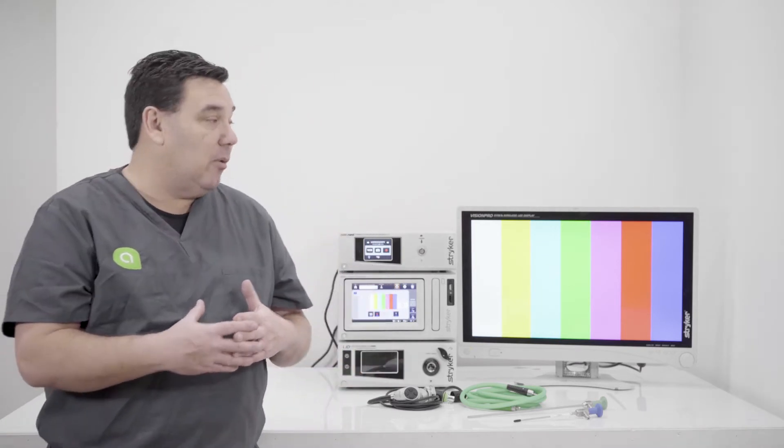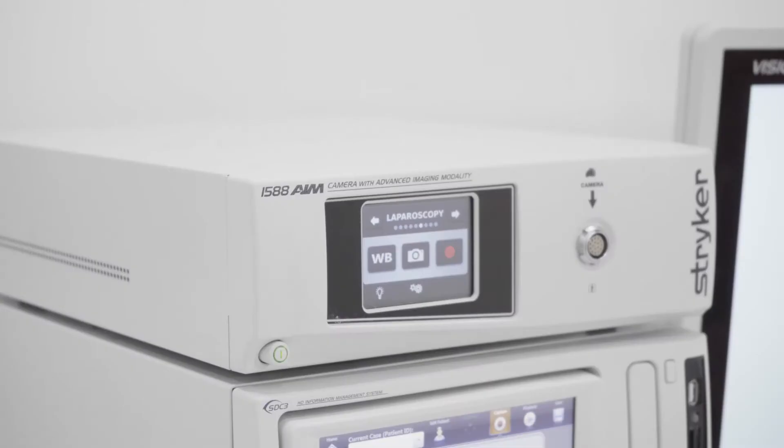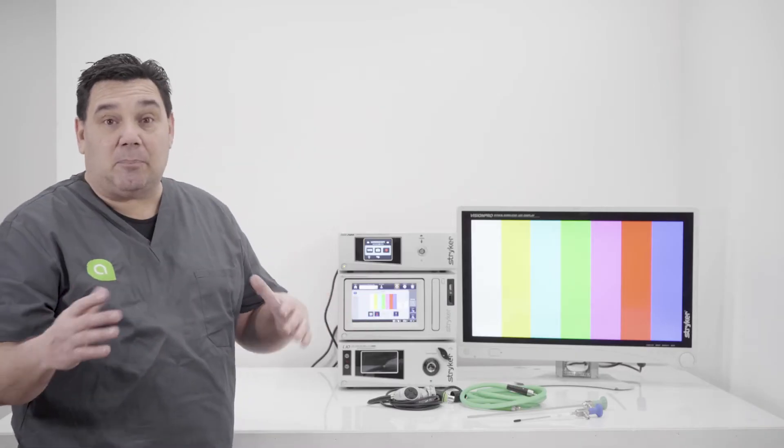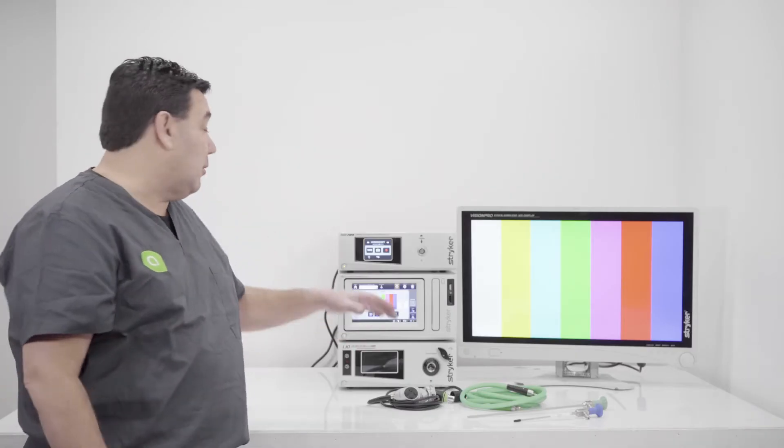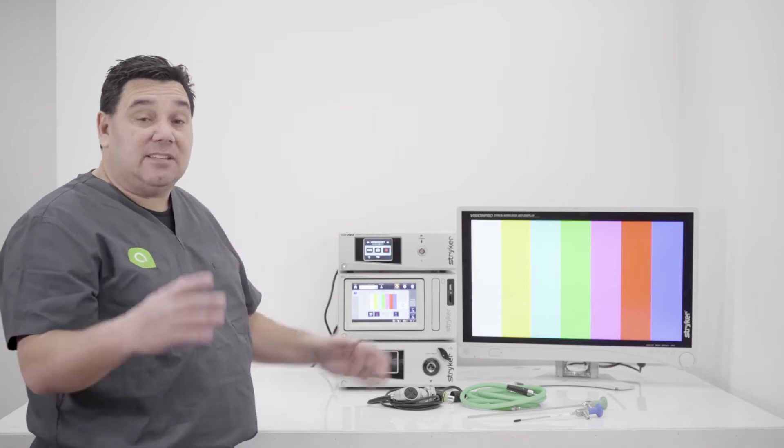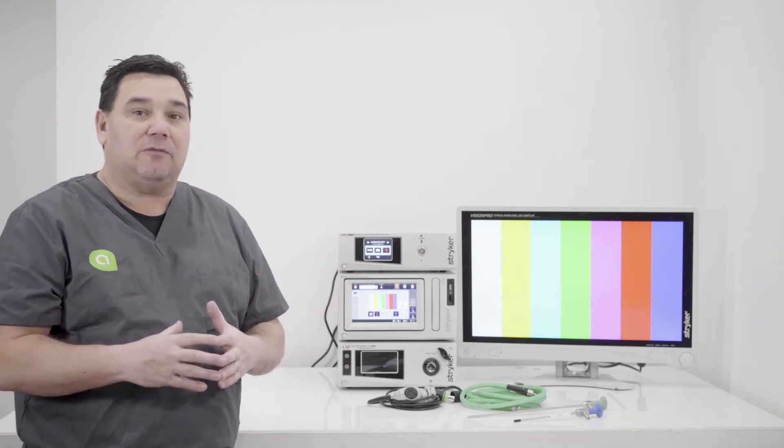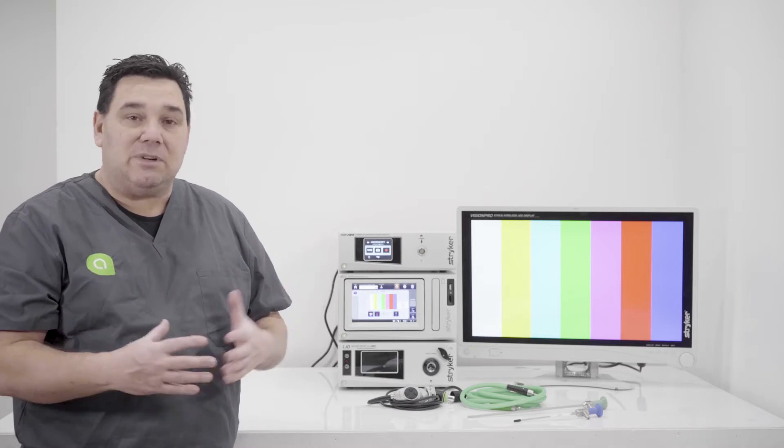So once you know those three basic principles, then adding components as you go along makes it a little bit easier. So in the case that we have set up, we have Stryker's 1588 AIM platform CCU.